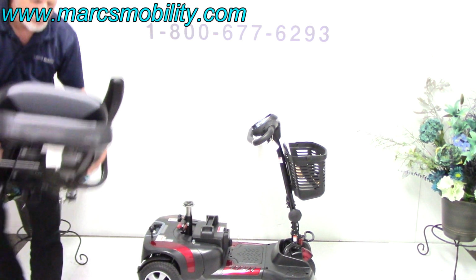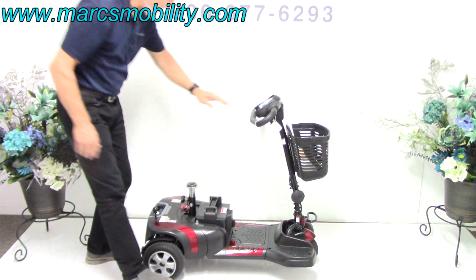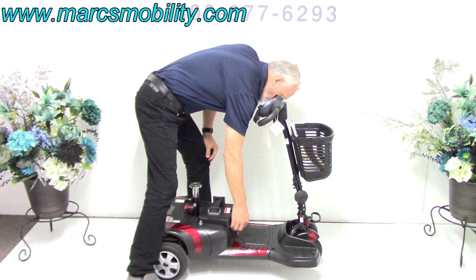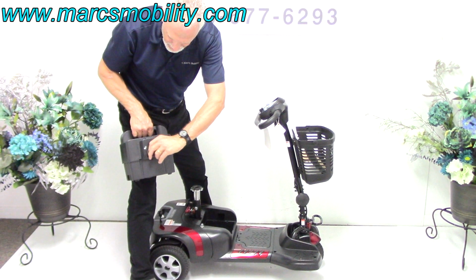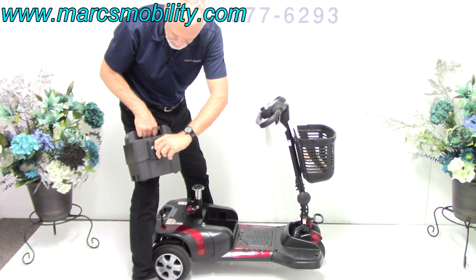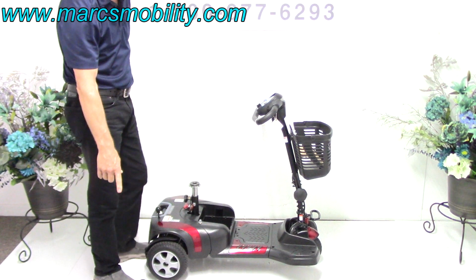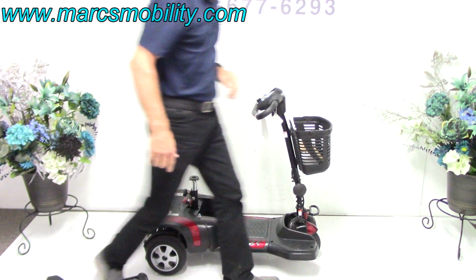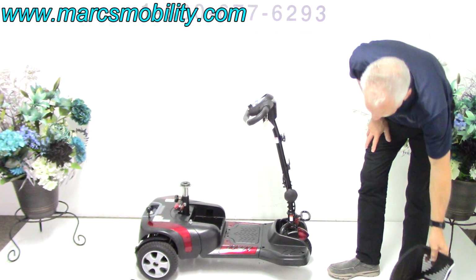So this is your seat, which is about 25 pounds. This is your battery pack over here. So you got to make sure before you pull the battery pack that it is unlocked right here, so you can pull the battery pack right out. There's a little lock right here. You can see lock, unlock. This is your battery pack, which is about 20 pounds. Then you would take your basket off, which weighs nothing.